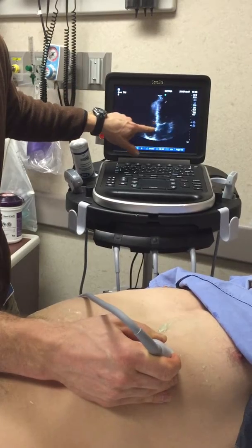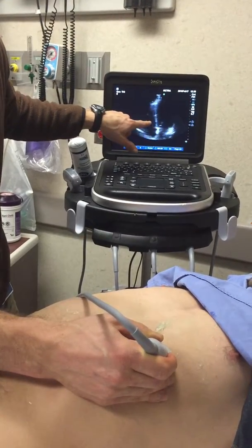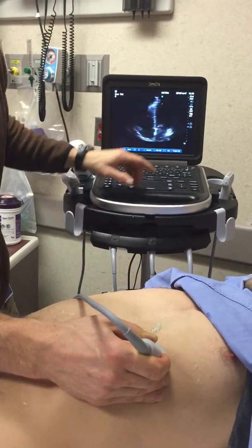See the septum in the middle. I'm sitting right on top of the rib with constant pressure. You can see both valves. You can see an overall large view of the 4 chambers of the heart.